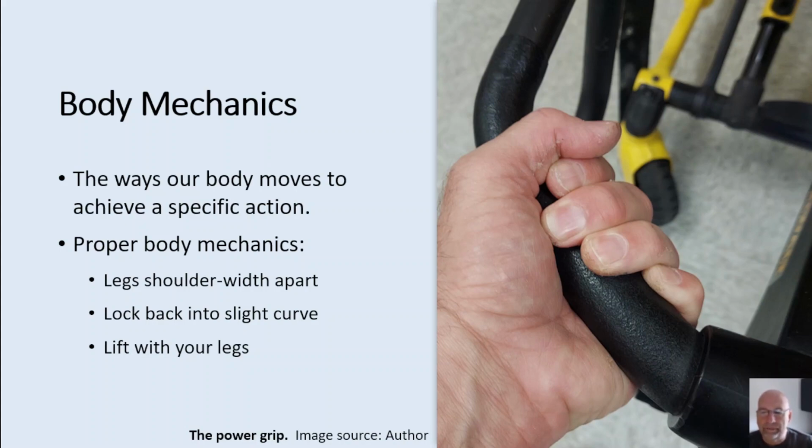When lifting, you want to keep the device close to your body and lift with your legs until you are fully standing. To lower a device, you will reverse these steps. You will practice proper lifting techniques in your labs.